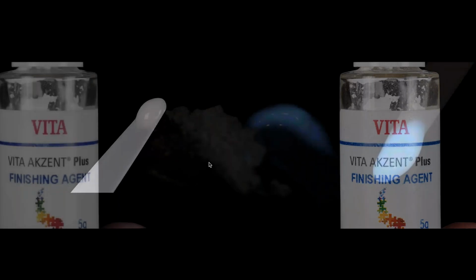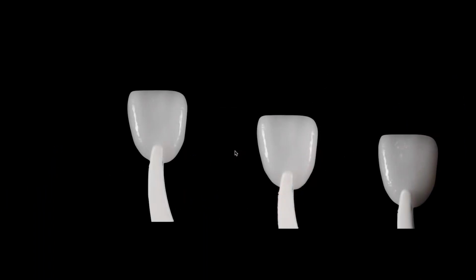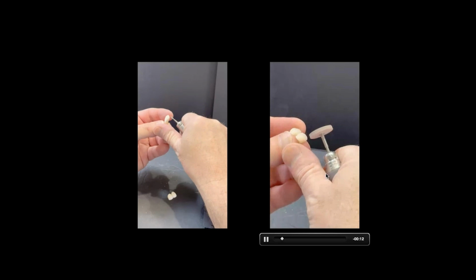So the finishing agent works nice. I still have high fluorescence with the glazing materials, but they can cut down that thickness or that viscosity of the glazing material. So whatever surface topography I put in, I can kind of repeat, and I'll get a much better look to the surface rather than having that bulky look.